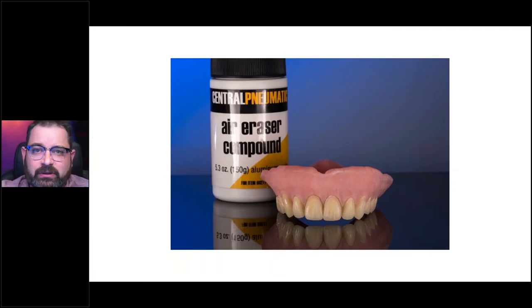Once the area has been reduced, if you're dealing with a milled or a processed restoration, you want to sandblast it. When you're dealing with a printed restoration, a lot of times those little waves you get from the prints could be sufficient enough for mechanical retention of composite to the restoration. But if you want to be sure, I would still sandblast everything. I usually use 50-micron aluminum oxide particles at about 15 to 20 PSI pressure.